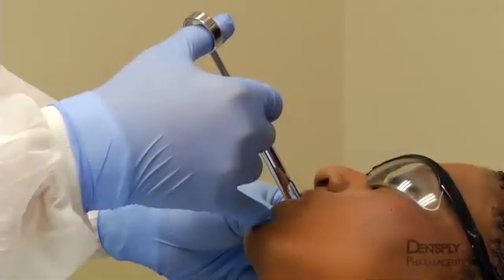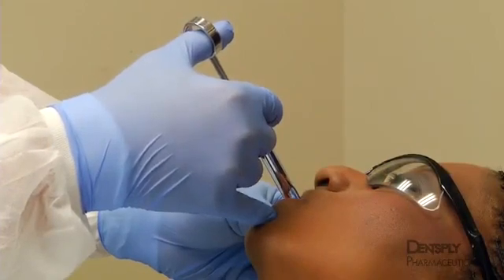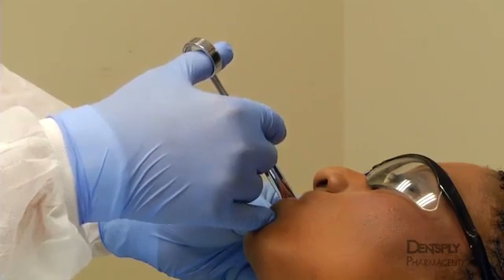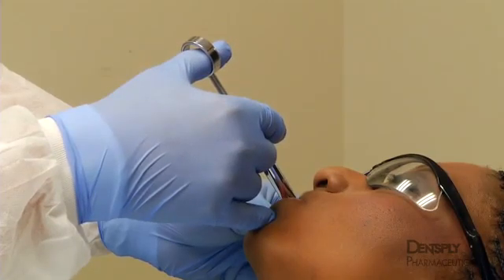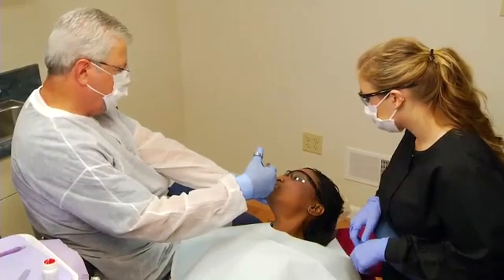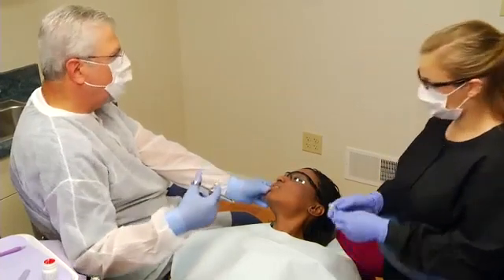As the needle is slowly advanced to its ultimate depth of 2.5 centimeters, a few drops of anesthetic can be administered to reduce discomfort during insertion. After a negative aspiration is obtained, the entire cartridge is slowly injected.